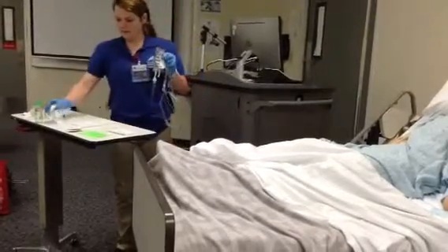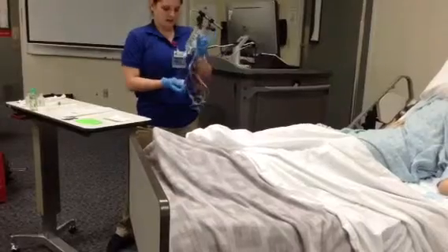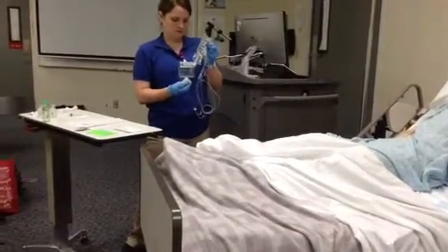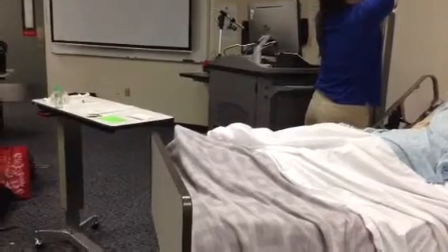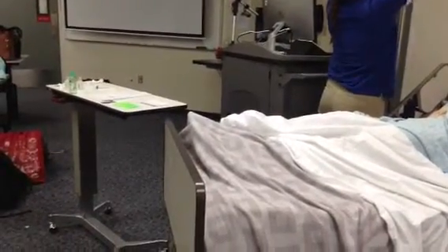And I'm going to put a label on my tubing. It's going to do the date, time, and my initials. So go ahead and hang his medicine. And I clamped back the medication so it wouldn't run everywhere.